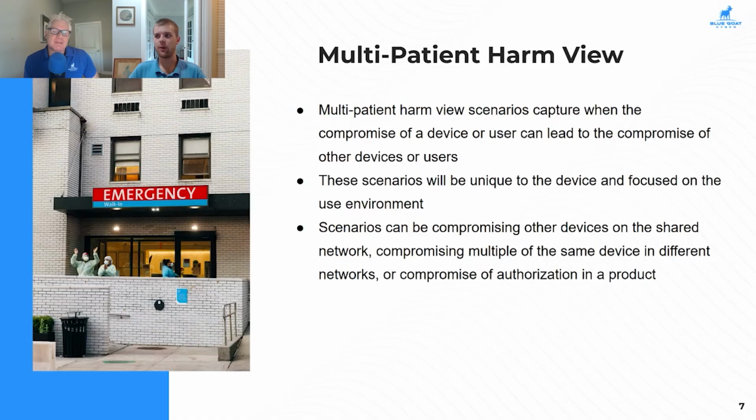Definitely. And there are some other situations that we have to capture as well. We have some examples that we'll dive into in a second, but we're talking about situations where ransomware is a hot topic for medical devices, for critical infrastructure. If a device gets ransomwared, what other devices on that network will also be ransomwared? That's something that we can think about from a multi-patient harm view angle as well.